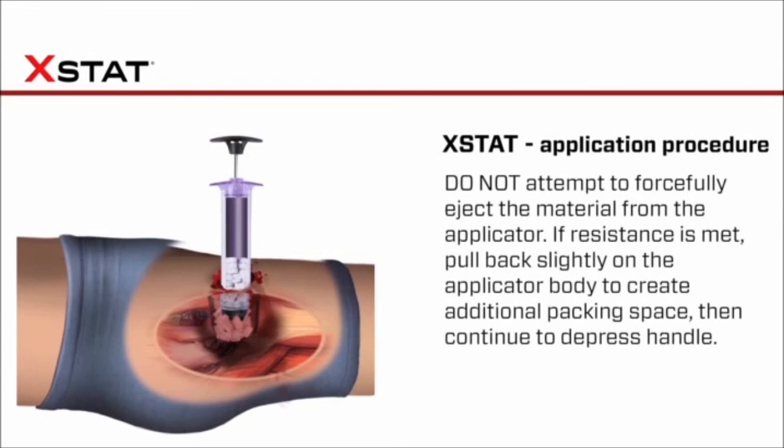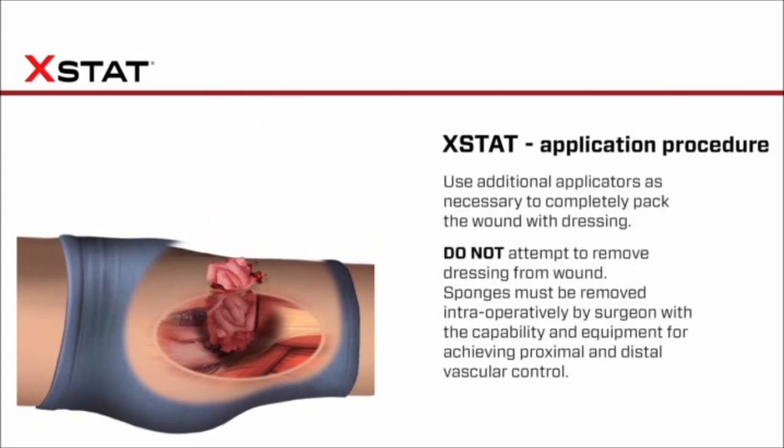Do not attempt to forcefully eject the material from the applicator. If resistance is met, pull back slightly on the applicator body to create additional packing space. Then continue to depress handle. Use additional applicators as necessary to completely pack the wound with dressing.